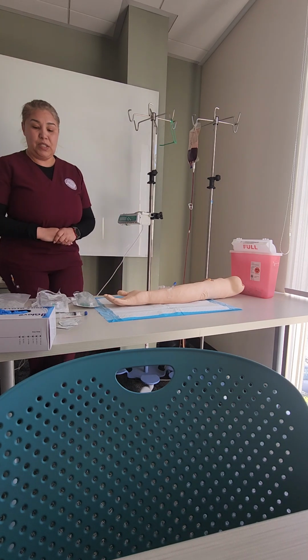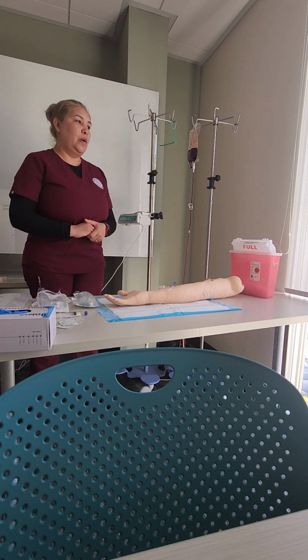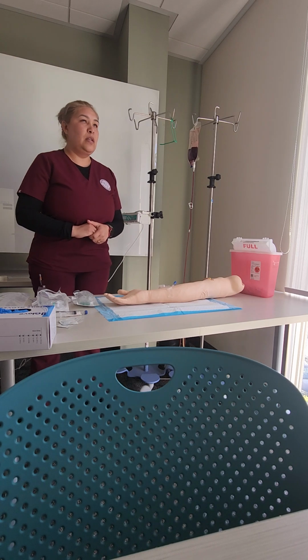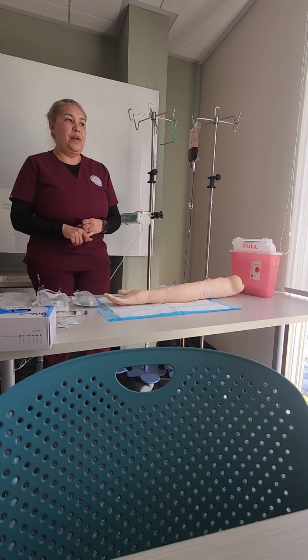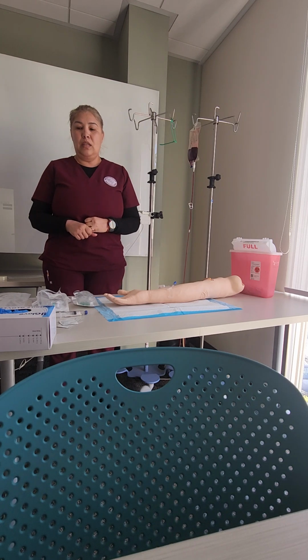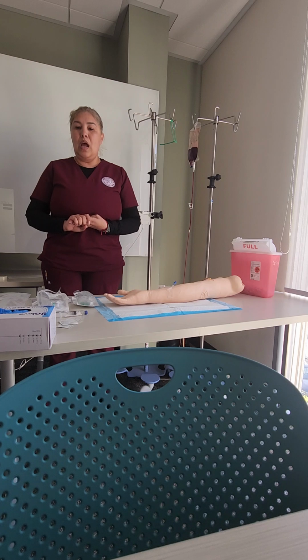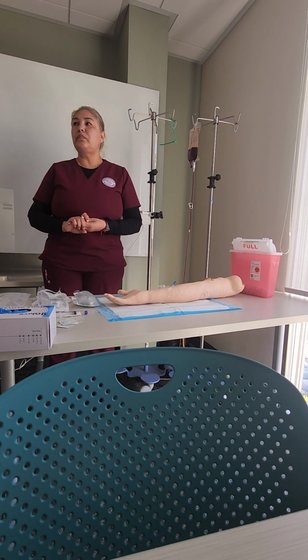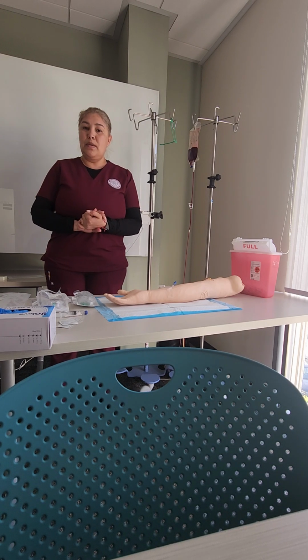Okay, so what I will do first is I will look at the MAR. I will go ahead and pull up the orders for my patient. I will make sure that I have the right patient, the right reason for the medication, the right route for the medication, and the right time and date. And of course, I want to give my patient the right to refuse. And I will document at the end.